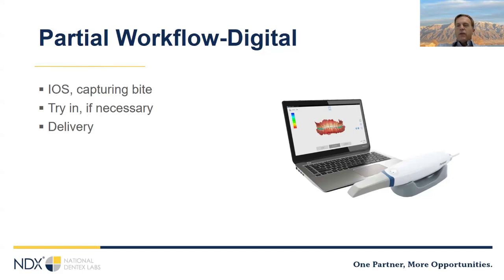So one of the other things I would say about laboratories is that some labs are more digital than others. Some labs are like, how can I do it digital all day, every day? Some labs are like, how can I take this digital data and put it back into my analog workflow? So when you're doing your first digital case with your laboratory, talk about the workflow. And if you're seeing too many appointments, push back a little bit. It's like, well, my patients would prefer that I do the least amount of appointments possible. How can we do this case in the least appointments? I feel like that is a fair question to ask.